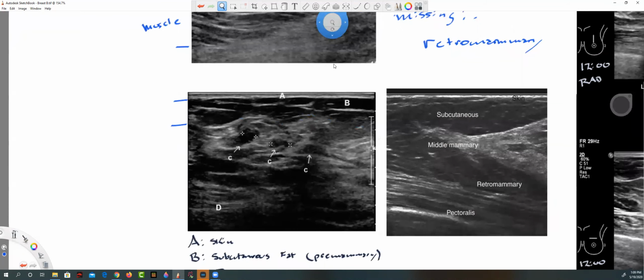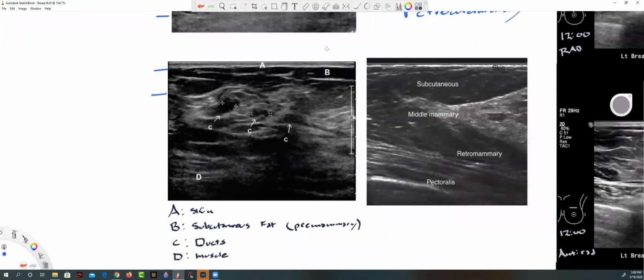Like I said, this imaging is a little dark for my taste. They've made the fat almost anechoic, like in the middle here. A little too dark for me, but whatever. From basically here to here is our mammary layer, and what we have here are some ducts. The ducts are a little bit prominent. Perhaps this patient is pregnant. I wouldn't quite say lactating, but it's slightly prominent.